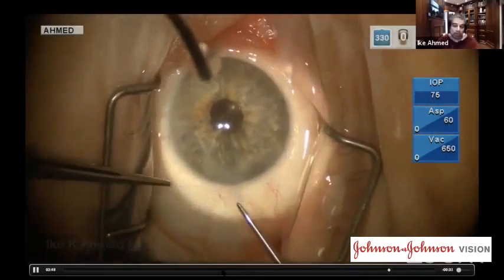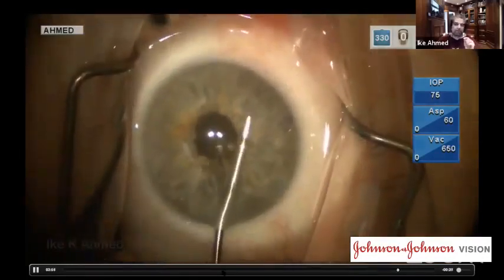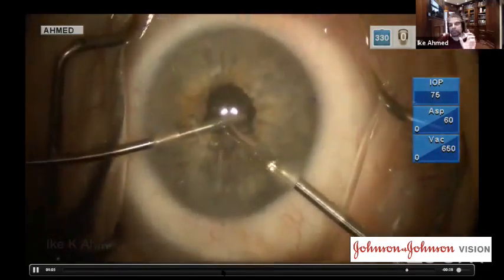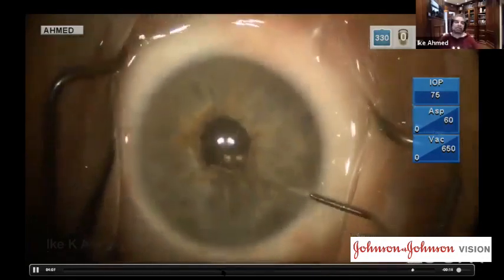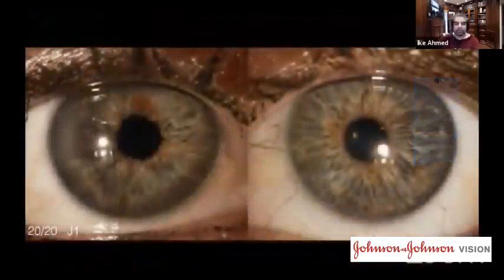Now we'll lock the suture. I have to say, I like to lock the suture. It takes me another 10 seconds to lock the suture, but it really helps me to ensure that that knot will be present and still. And 3.5 millimeters does allow good peripheral retinal visualization with scleral indentation or a wide field contactless viewing system in the OR. There's our pupil, and we can see the pre and post as well.